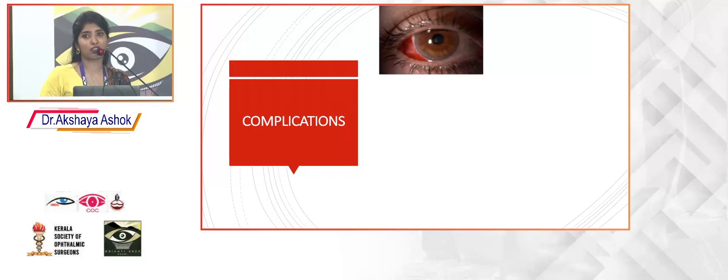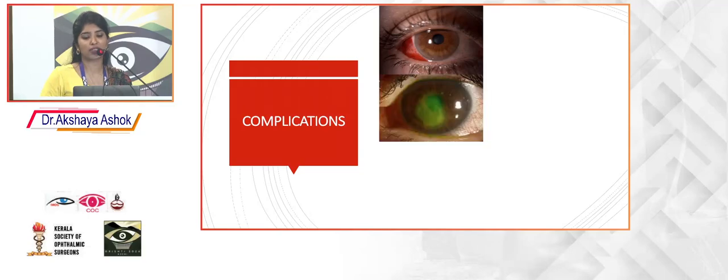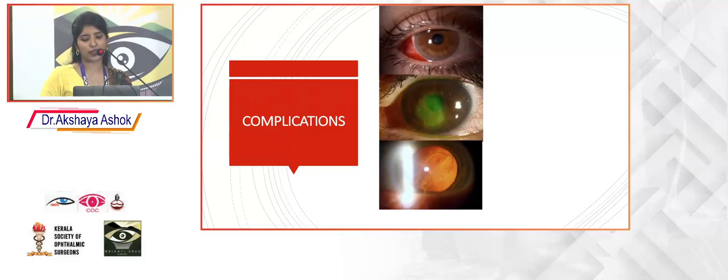The patient will obviously get scared seeing those bright red spots in the eye, but all you have to do is tell the patient that it's going to fade away in a few days. The second complication that could occur is development of a corneal epithelial defect. This usually occurs when the patient, under the effect of anesthesia, tends to open their eyes under the drape, and the drape rubs over the cornea. So if the patient complains of pain the next day, day one following the injection, most probably it's due to an epithelial defect. It can be treated easily with copious lubricants. It's going to heal in 2 or 3 days.